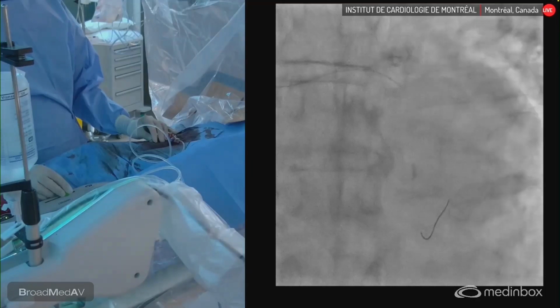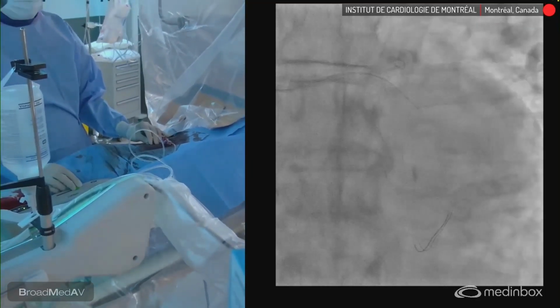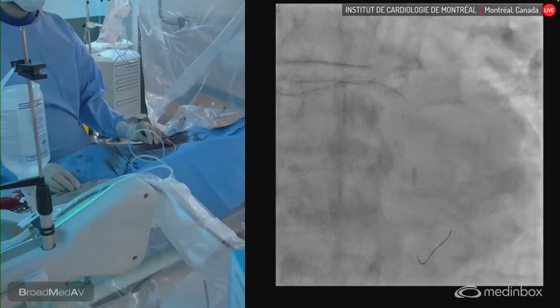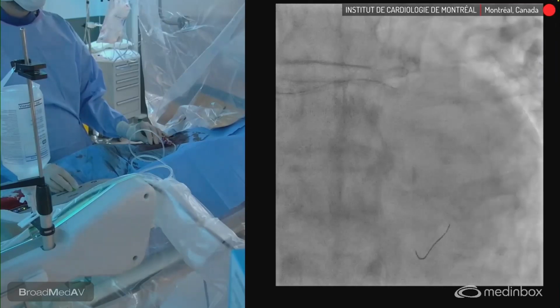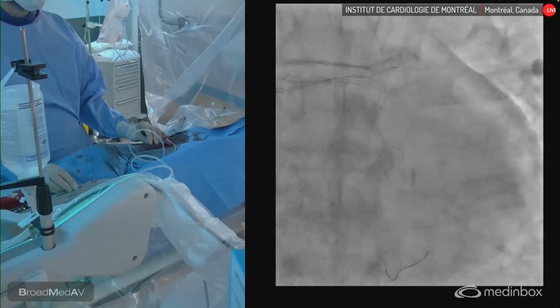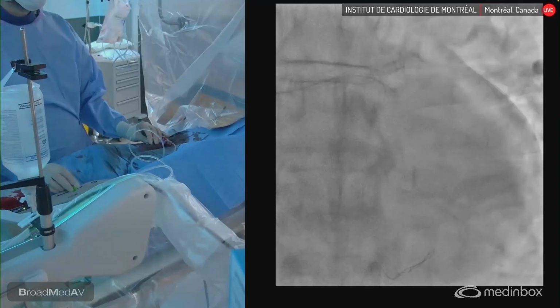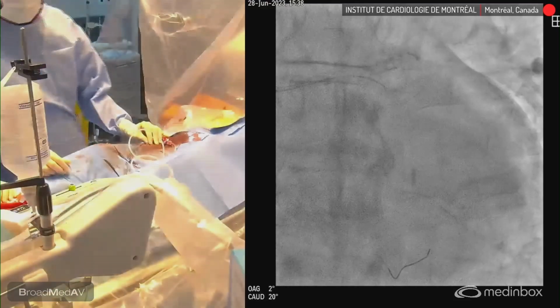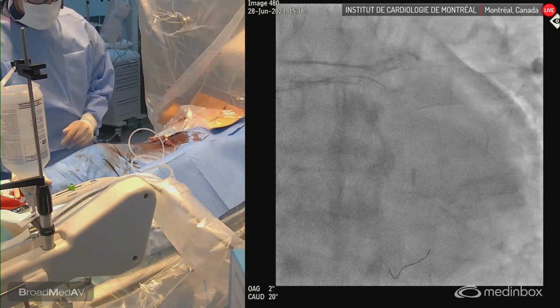And we listen for tonal changes. Already, I don't hear the changes anymore. So I think you made your way there. I think we did. There is a bit of change in the mid portion, however. Yeah. We could go a few more times. Yeah. Go in the midsection a bit because we saw this. Okay, we'll wait a bit and we'll do another run, and maybe I go in the mid circumflex, because we saw a change.